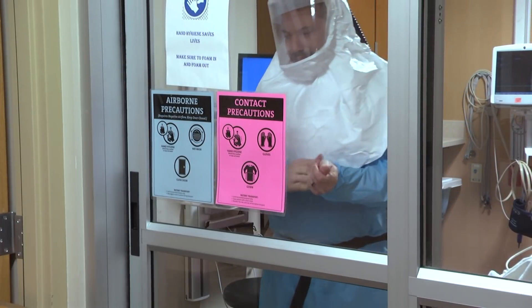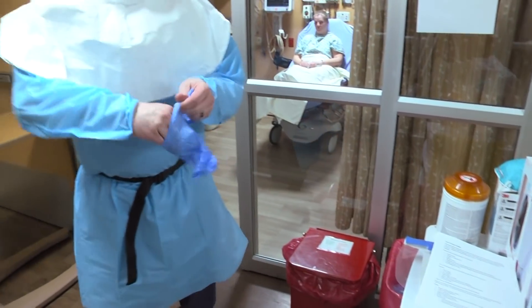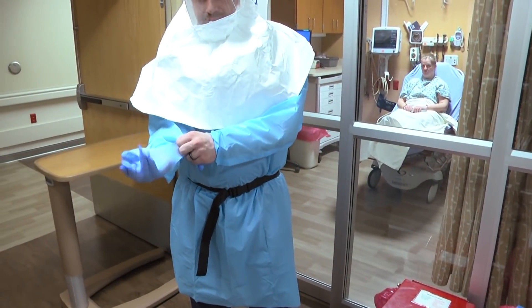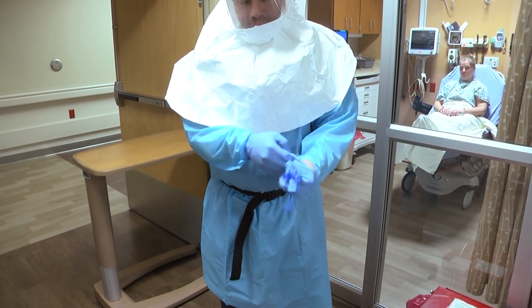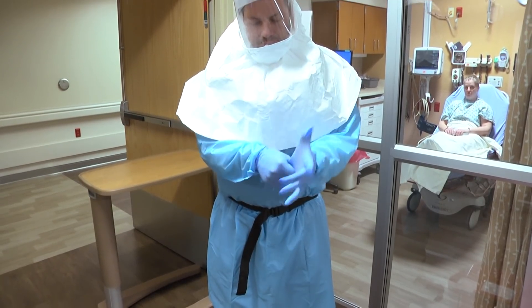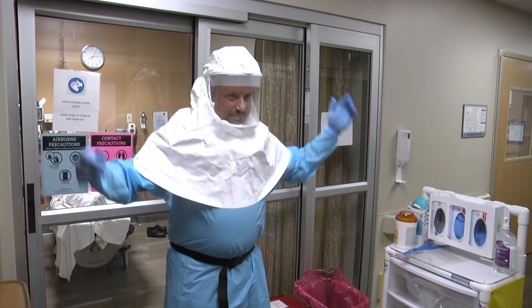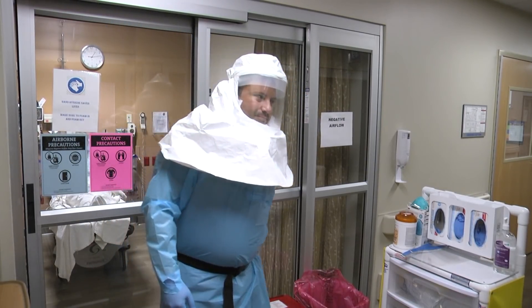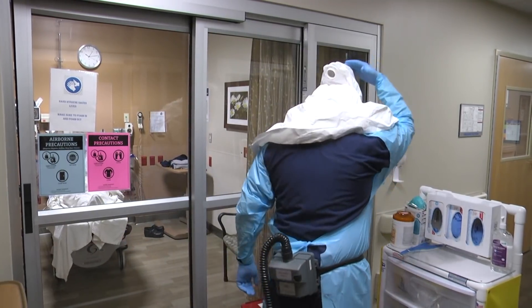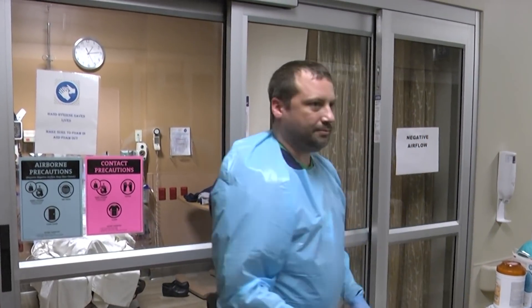Leave the room and close the door. Put on clean gloves. Disconnect the PAPR. Remove the PAPR hood and place it in the biohazard trash. Remove the PAPR and place it in the designated transport container.